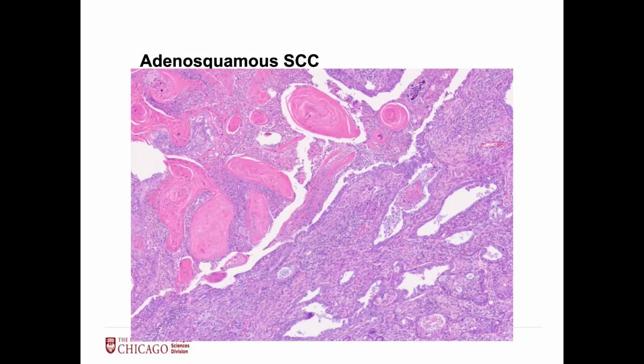You could always send for FISH. I've had all situations happen where I said suggestive of adenosquamous or cannot rule out adenosquamous on biopsy, ended up being just squamous with overgrowth of glands. I've had a case where I said suggestive of adenosquamous on biopsy, ended up being adenosquamous on the resection. And then I've had a case that really bothered me for mucoep because the cells were a little bit more epidermoid, like mucoepidermoid carcinoma is just bigger, pinker, almost intermediate looking cells. And we sent it for FISH and it was mucoep. So those are some thoughts to think about in adenosquamous carcinoma.